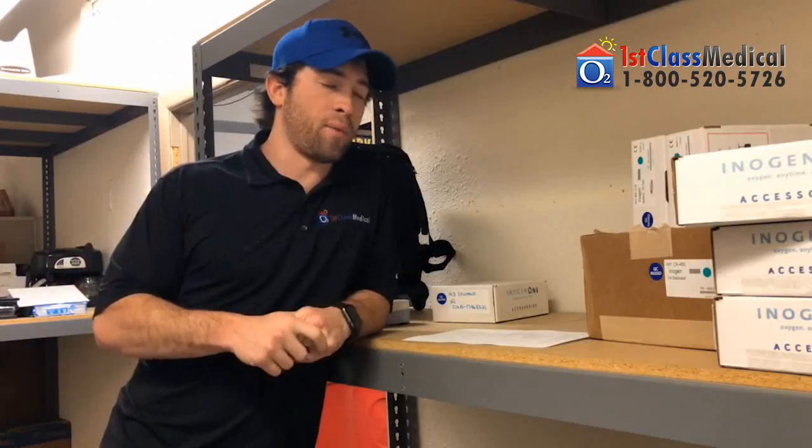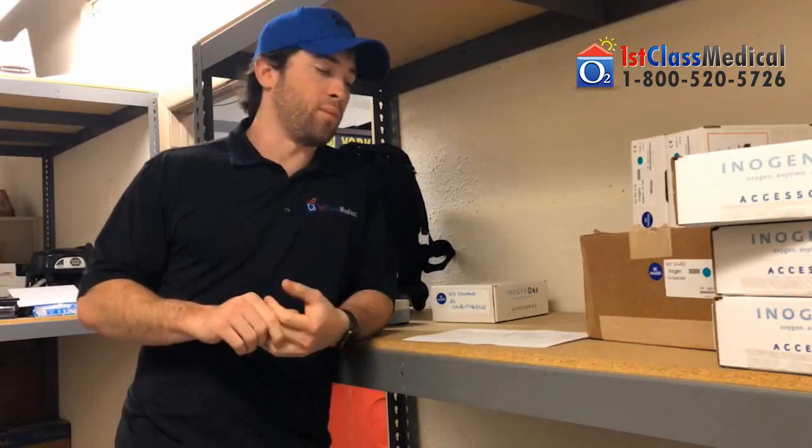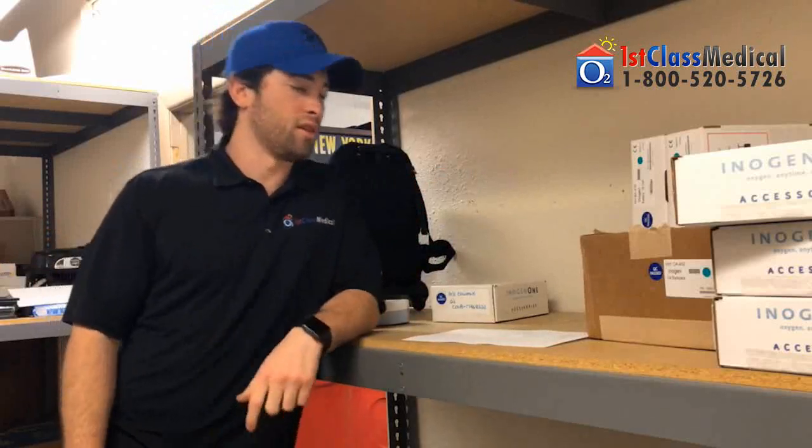We try to do a good job of making sure that we guide you into a portable concentrator that gives more oxygen per pulse, because that's obviously what you're looking for when purchasing a portable. But there's no real comparison between continuous flow and pulse flow. So when you call and ask, hey, can I use this, can I use this? Well, there's no way of really knowing without you getting tests done with your doctor or personal use.